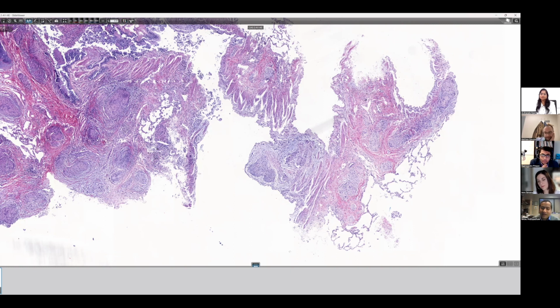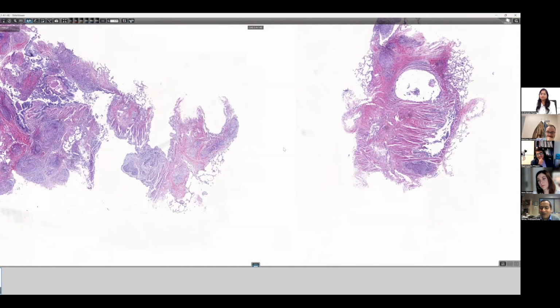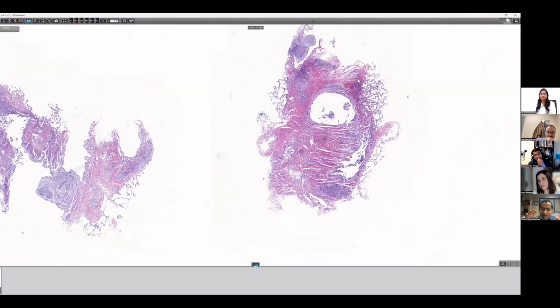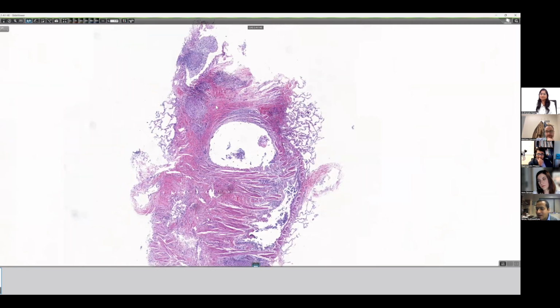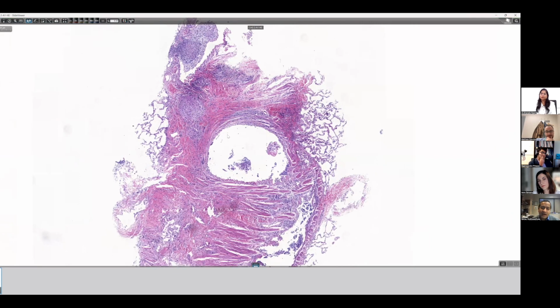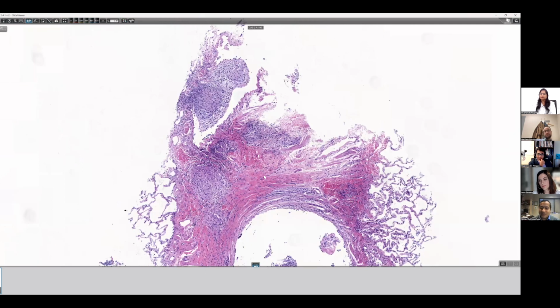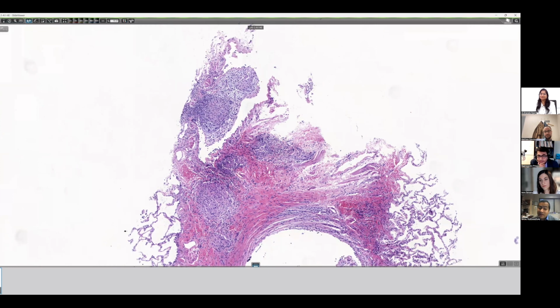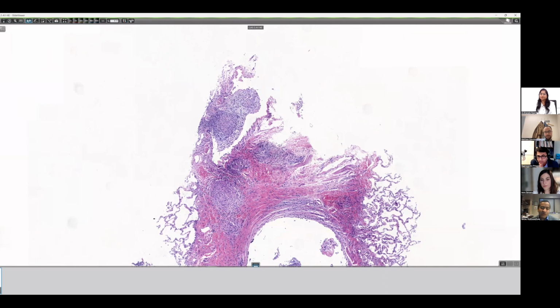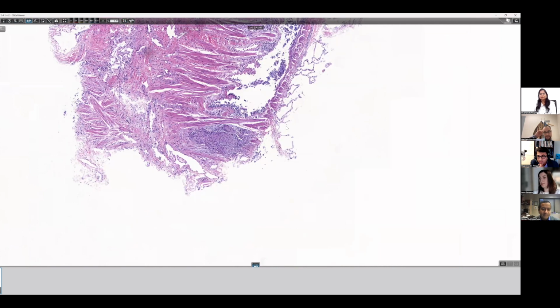We know that these antibodies are non-specific, and they don't necessarily mean that the process in the interstitium is related to the antibody. But when it comes to a fibrosing interstitial pneumonia, we don't have any confidence. The moment it comes to interstitial fibrosis or chronic inflammation, everything becomes hypersensitivity if you have some kind of clinical indication. So I think we are not skeptical enough in that setting as we are here. Appropriately, in this case, we are skeptical and we are saying, oh, no, you can have antibodies. Anybody can have antibodies to a parakeet. But that also applies to the fibrosing interstitial pneumonias. Agree. Great point. Should we move on to the next case?